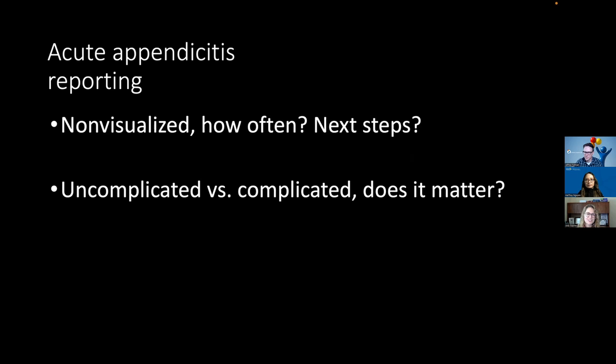Yeah, I'll let Jeffrey talk now. So for our internal data, we have an ongoing QA project that's been going on for several years, where one of our sonographers keeps track of all of our appendix stats. For each individual sonographer, they keep track of how often they visualize or non-visualize the appendix. They keep track of the performance of each tech, and then send out an aggregate for our whole group. It varies. We range between about 70 to 75% visualization. That includes fully visualized and partially visualized appendices.